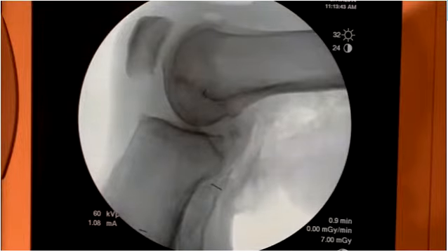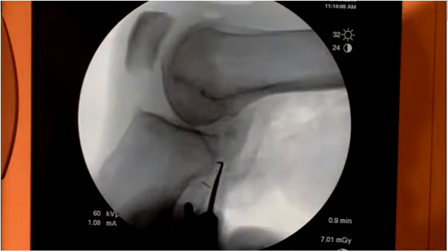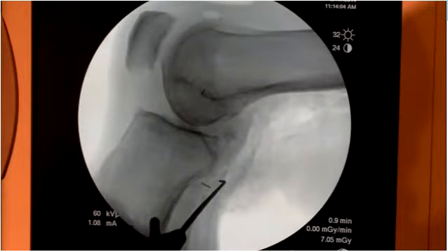Can you show us where the popliteus is, Charlie? I did not do that dissection, but I'm going to stick a probe back here. Another shot? Okay. I would think it would be about there. How about on the femur?